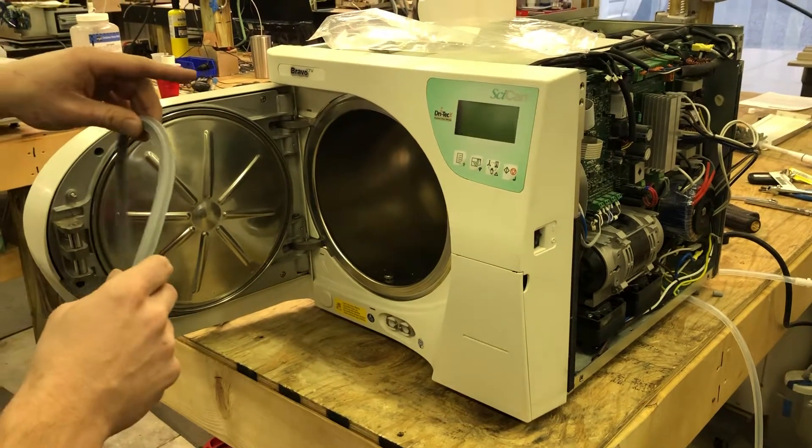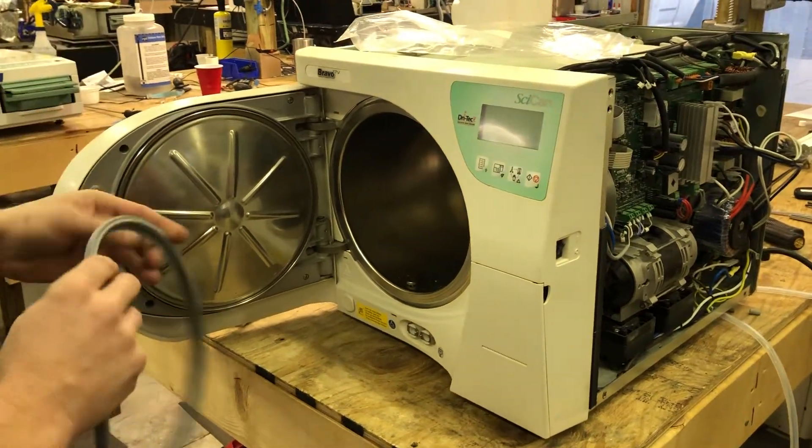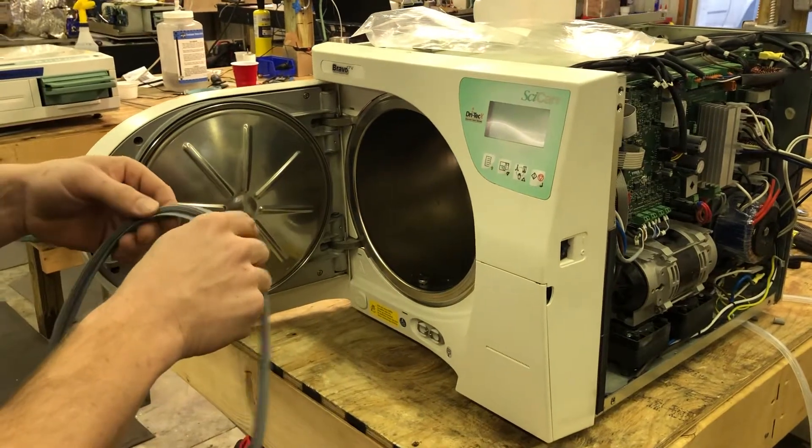I've got a Bravo 17V right here. I'm going to install the door gasket on. It's real easy — I'll just show you how to do it.